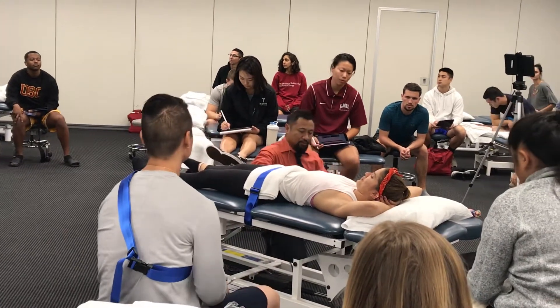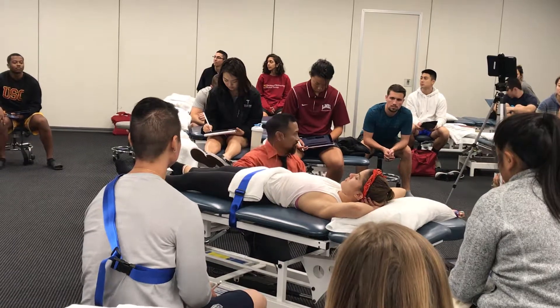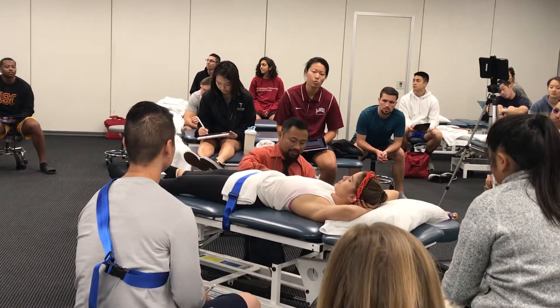That's part one. Part two, I want to make sure that the belt buckle is not on the patient. That belt buckle will cause some sort of discomfort as I tighten it up.